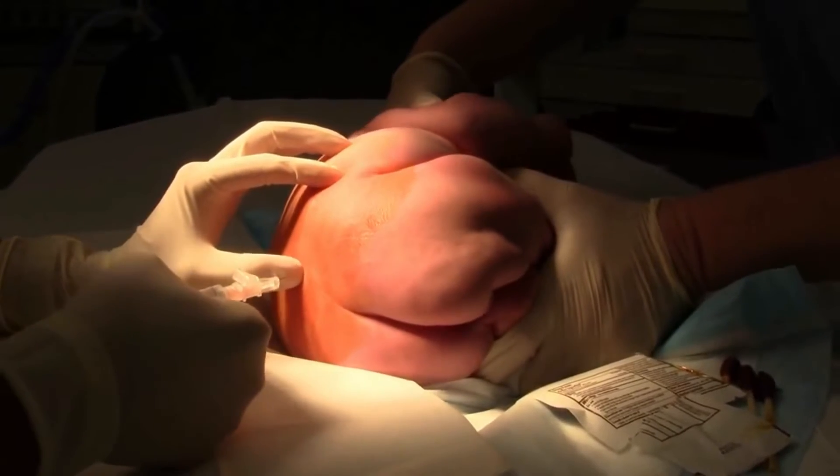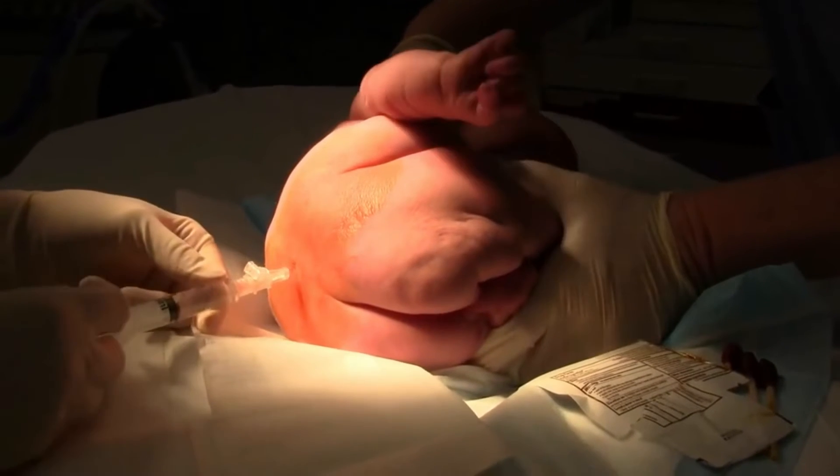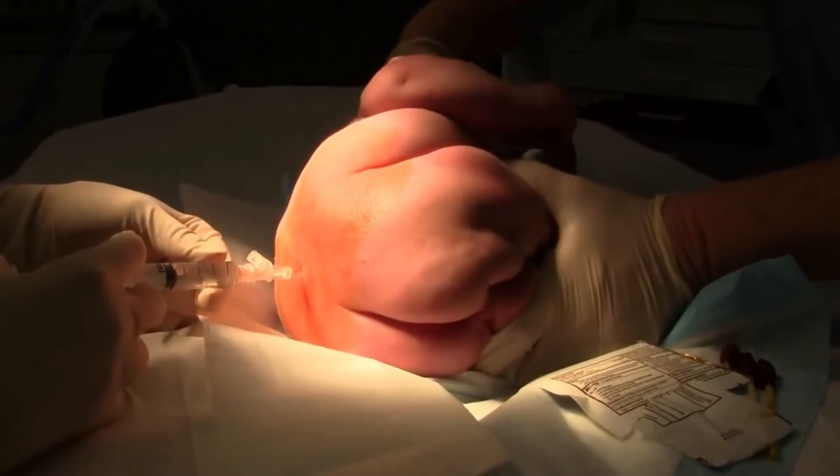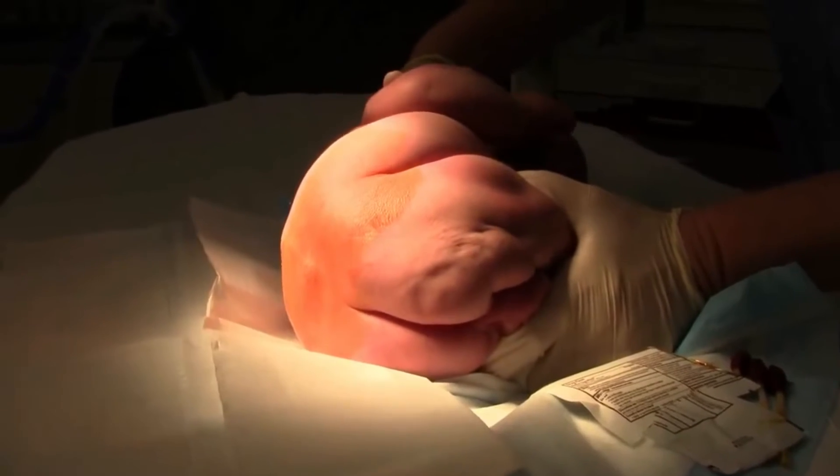Once the area is clean, a local anesthetic is administered to minimize discomfort during the procedure. Many clinicians fail to use anesthetics such as lidocaine, but this step actually increases the success rate of the procedure.